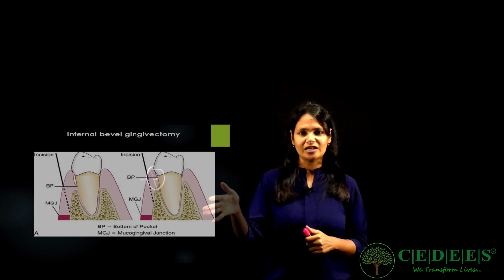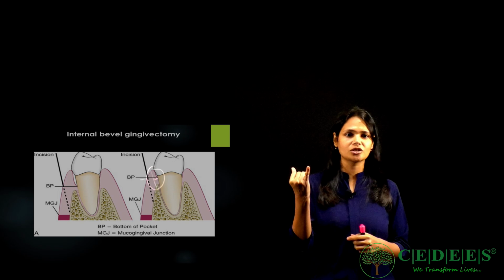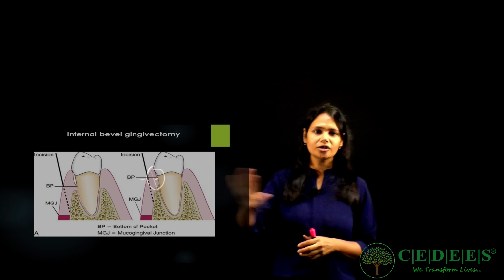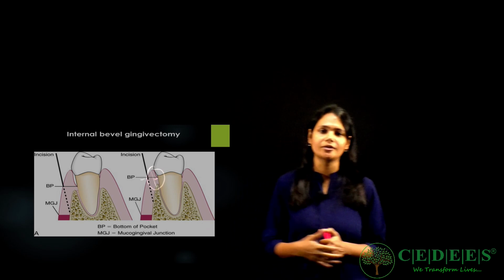Technically, it is not a gingivectomy, but it is known as internal bevel gingivectomy because one, you are giving the internal bevel incision, the bevel is inside. Gingivectomy because like gingivectomy, you are cutting a huge amount of tissue. So this is not advised, not routinely done, only for very specific indications it is done.